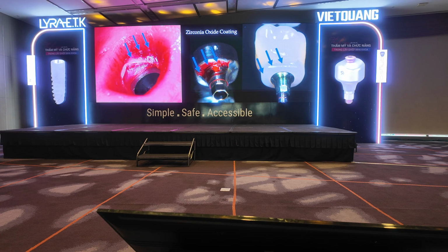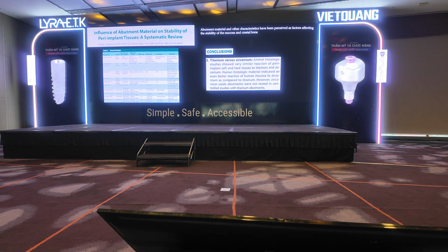By polishing the zirconia, we will have a zirconia oxide on the top, and this zirconia oxide is apparently the same as the zirconia oxide on the iphysio. We would love to never remove the iphysio. It would be the best to have a piece of iphysio where you can put the provisional on it and then put the final restoration on it in order to have one abutment one time. We never remove it. You have this healing done immediately on it.